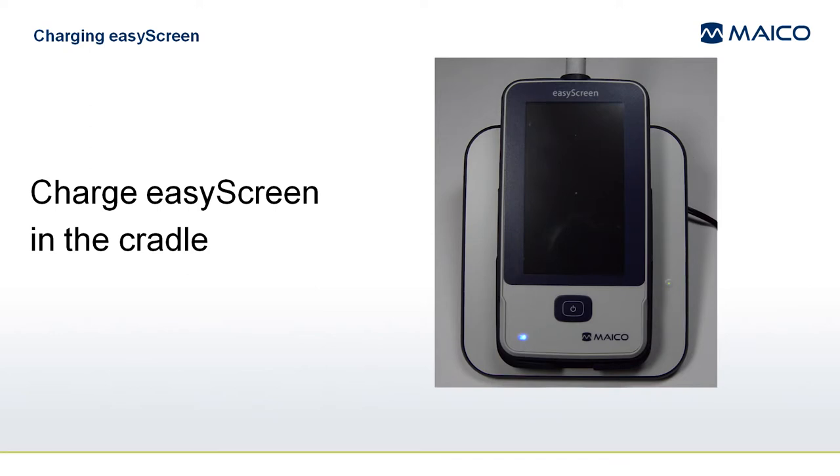If the device is switched on, then you will see a charging battery symbol in the upper right corner of the touch screen display. The LED will not be lit when the display is on. The device will charge faster when it is switched off.